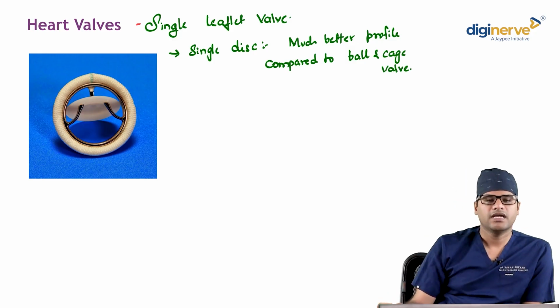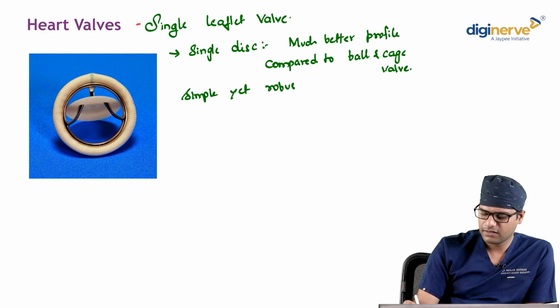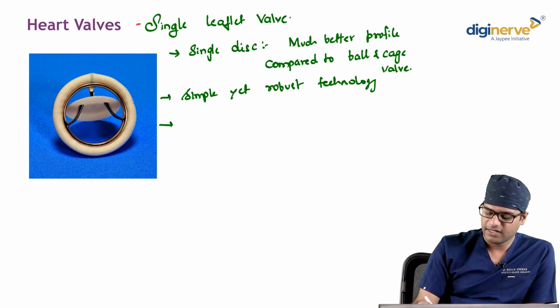It is pretty simple, yet robust technology. Of course, it requires vitamin K antagonists.